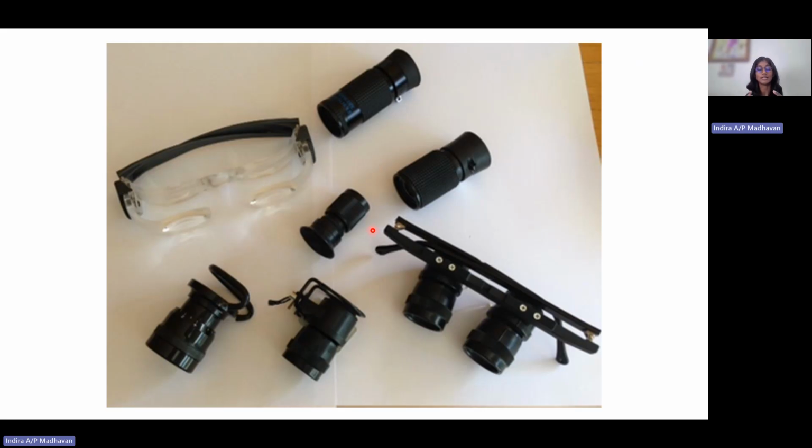So that's why we say that when a person is wearing a telescope, the field of view is restricted. They won't be able to see the whole picture of the world. So this is not comfortable for a person who's using it, because they're used to the whole world, and suddenly now their world gets smaller with the telescope. So that might not give a comfortable vision as spectacles.